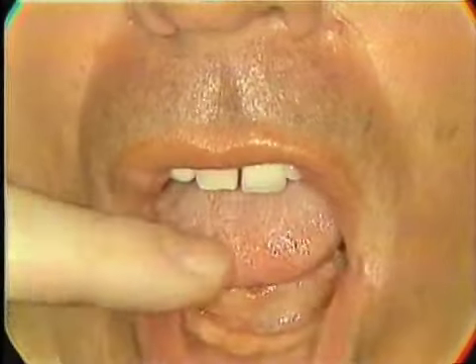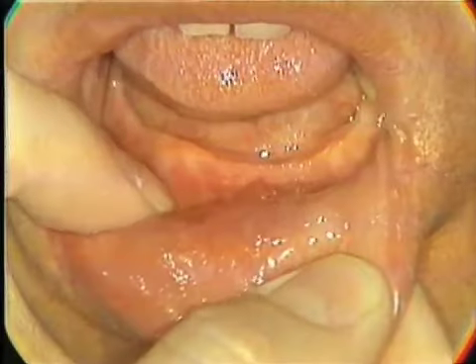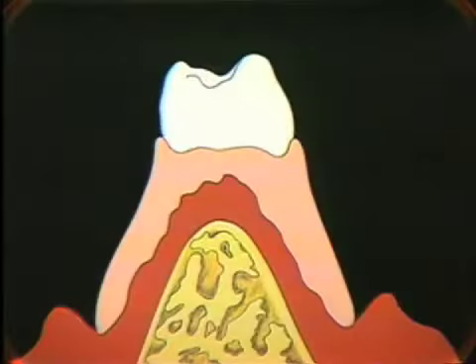Here we are going to record the details of the ridge in an undistorted condition, so that now when we make a base to fit this ridge in the resting position, we will have intimate contact of that base with the tissue when the tissue is at rest, so that when this base is put under function, we will not have any movement of the base. Or if any movement occurs, the only movement that could occur would be from compression of the tissue, if this does exist.